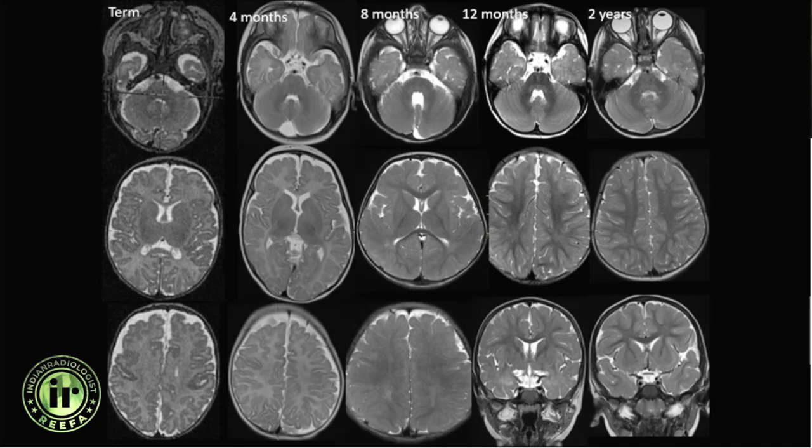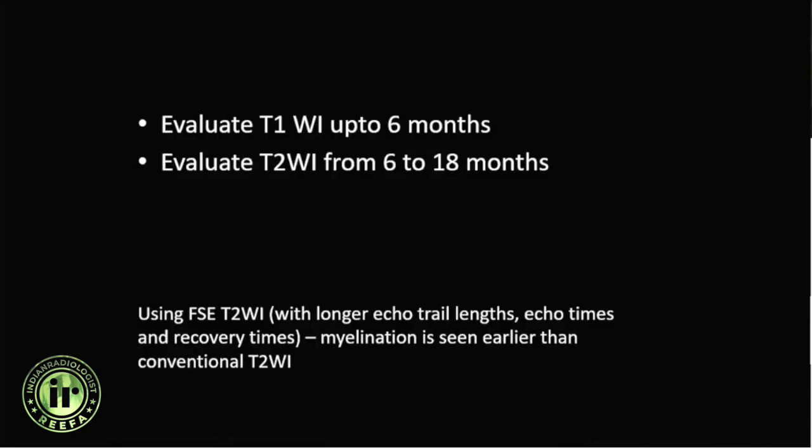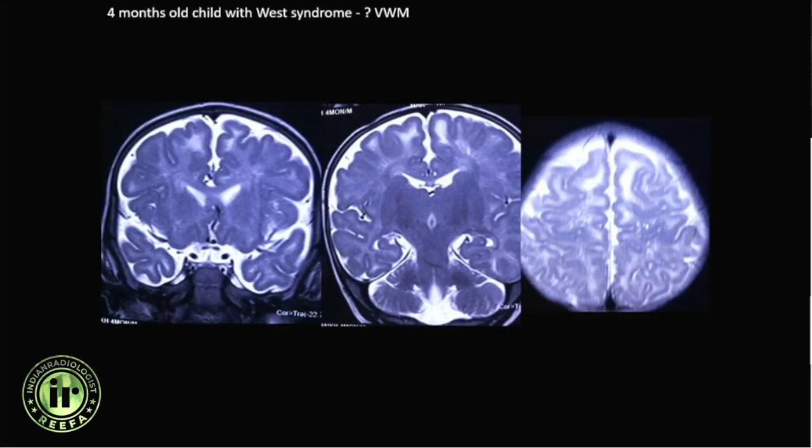Myelination progresses in the frontal and temporal subcortical U-fibers last — the temporal subcortical U-fibers are the last parts of the brain to myelinate. In the earlier stages of life we evaluate T1-weighted images, and after around six months to one and a half years myelination is evaluated on T2-weighted images.